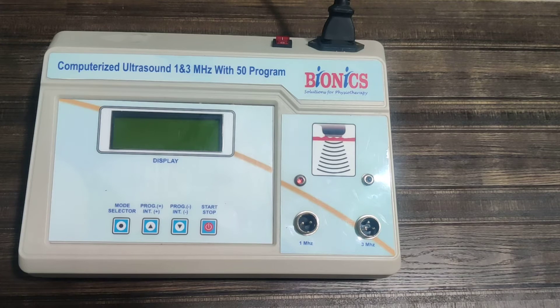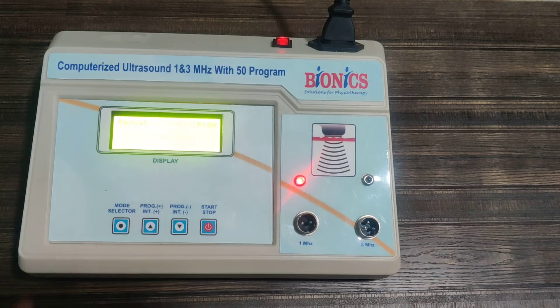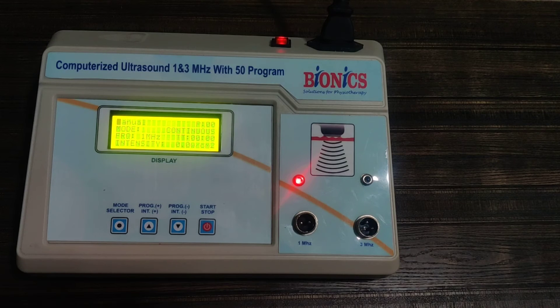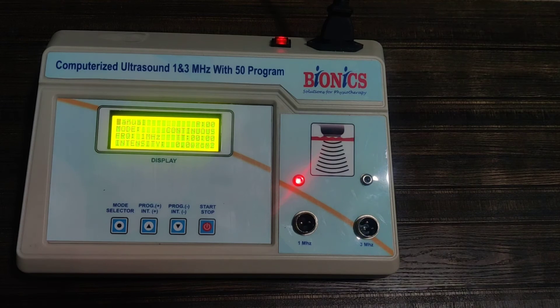Welcome to Bionics channel. This is a demo of computerized ultrasound 1 and 3 megahertz. To first switch on the machine — the machine starts in manual mode. It also has 50 programs, so if you don't wish to use a program, you have to work in manual mode.